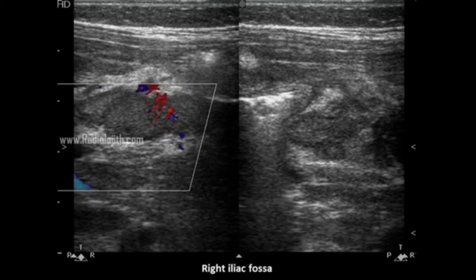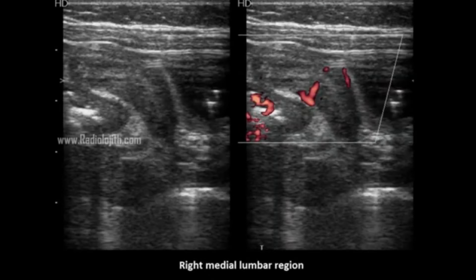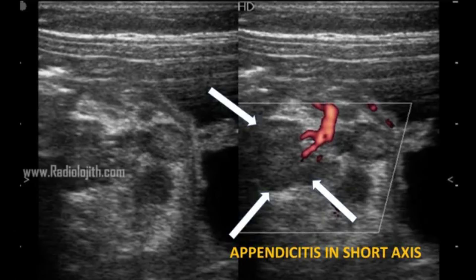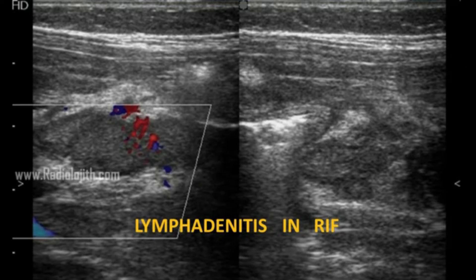Now we will go for discussion. There is a long non-compressible, non-peristaltic, tender tubular lesion of 7 mm in thickness seen in the right medial lumbar region with significant hyperechoic thickening around it. Few dilated bowel loops are observed near the lesion with significant mesenteric lymphadenitis. No major fluid collection is detected.